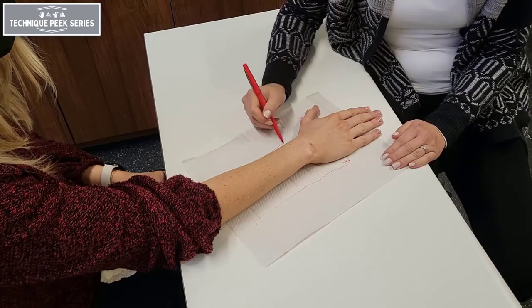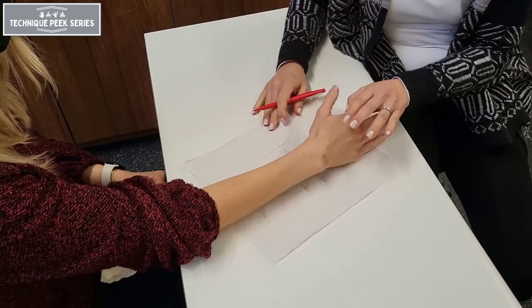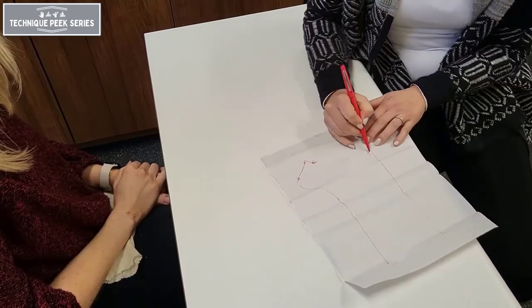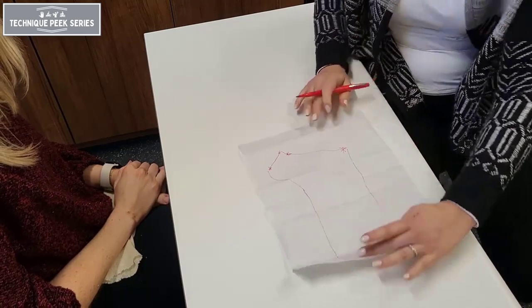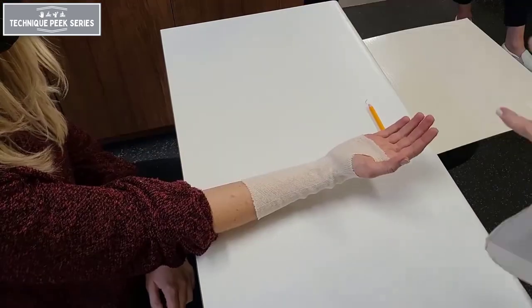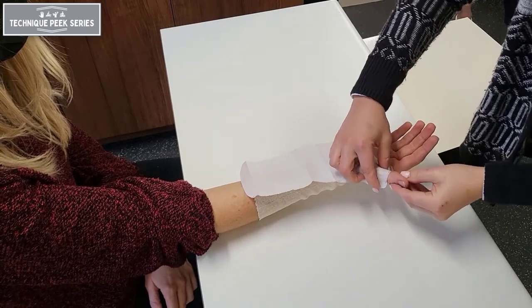Once we have our landmarks, we're going to connect the dots to make our completed pattern. Here you can see the completed pattern for a forearm-based thumb spica splint. Before tracing your pattern onto the splinting material, check the appropriate fit on your patient using the pattern.